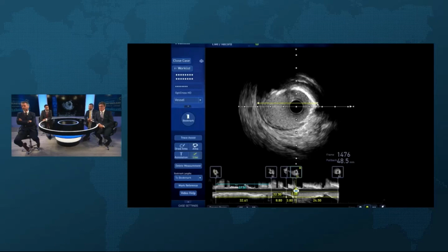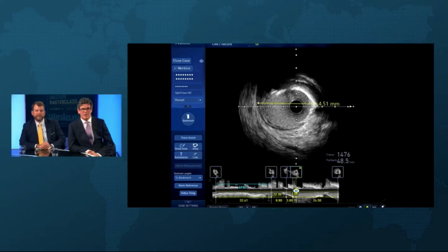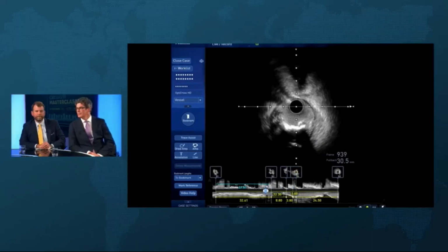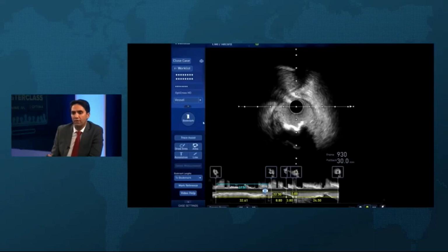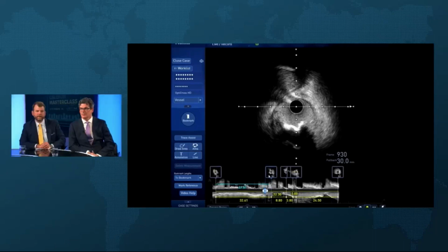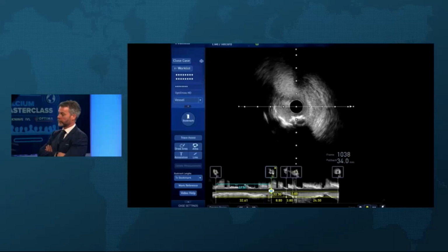That's the only thing that I wanted to make sure, that we were able to get that stent size up appropriately. So we'd need a 3.0 that went to 4 or 5. So the other argument is can we just stay distal to it and take a bigger one if we've got enough length. I'd stay smaller distally and then go bigger proximally because it just gives you much more dynamic range. I'm a little worried about being able to get the stent to the appropriate size there. What does your left main measure now? I mean, it looks getting on for 6.